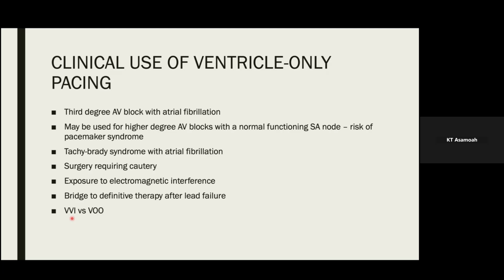Tachy-brady syndrome with AFib, the explanation is pretty much the same as third degree AV block with AFib. And then again, for surgery and electromagnetic interference, those ones you do VOO, which is ventricular only pacing or asynchronous ventricular pacing.